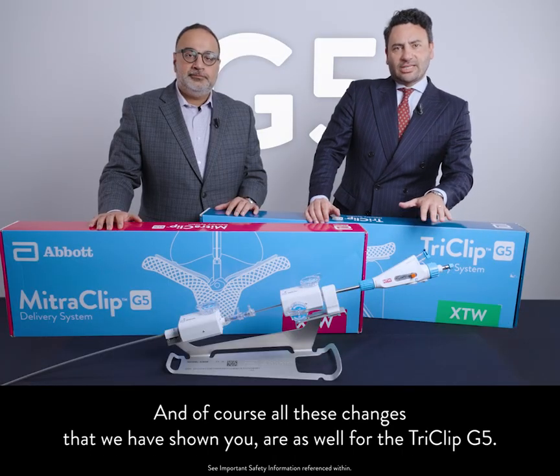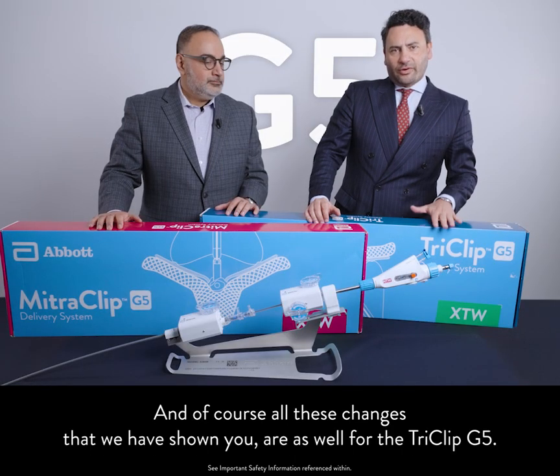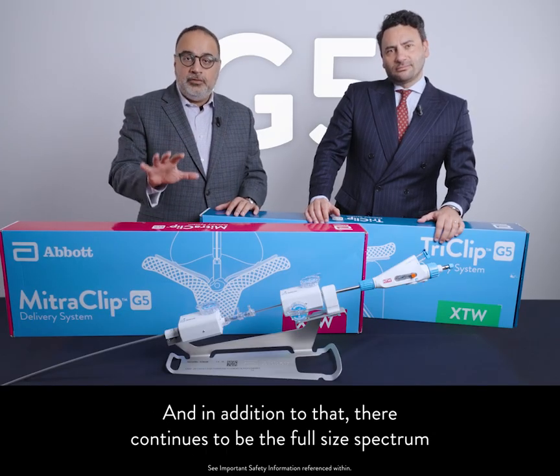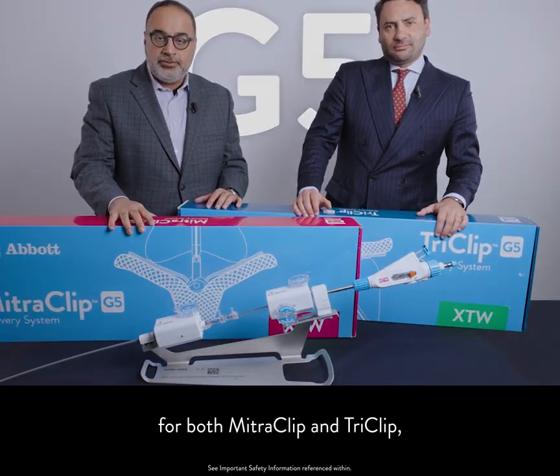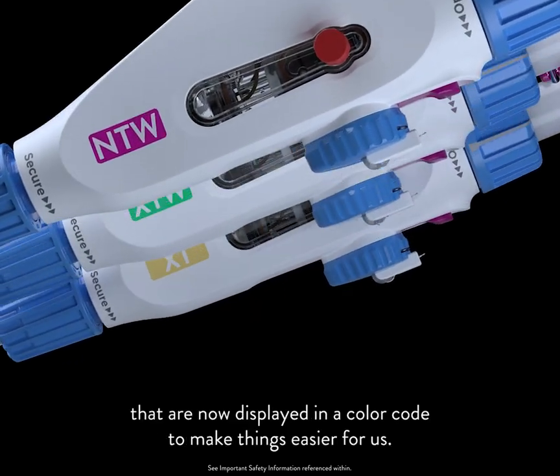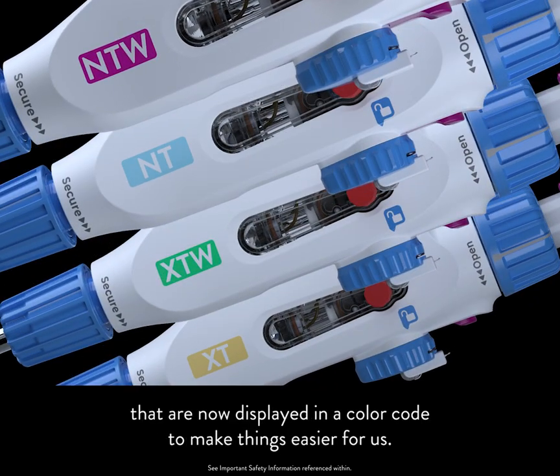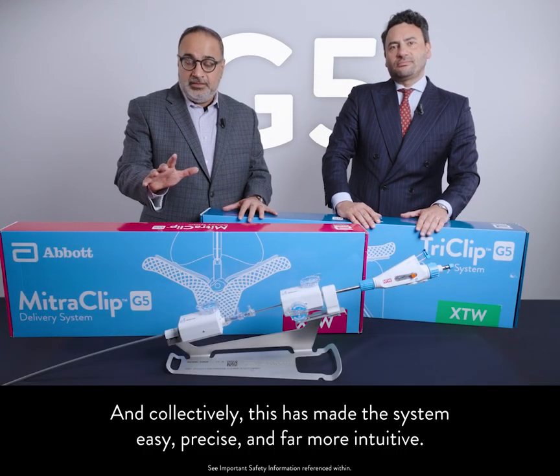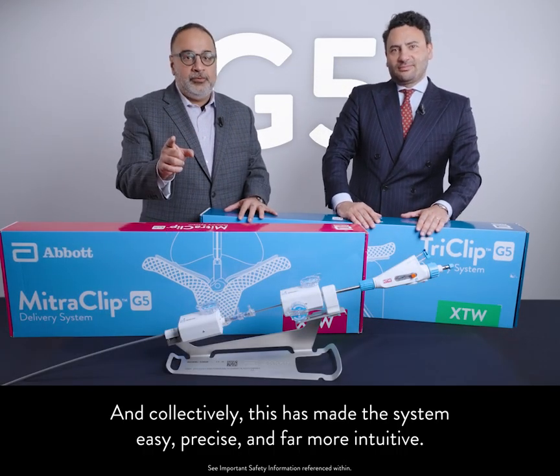All these changes we've shown you apply as well to the TriClip G5. In addition, there continues to be the full size spectrum for both MitraClip and TriClip, now displayed in a color code to make things easier. Collectively, this has made the system easy, precise, and far more intuitive.